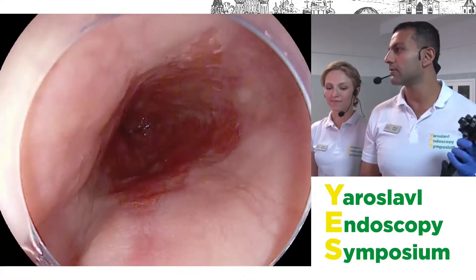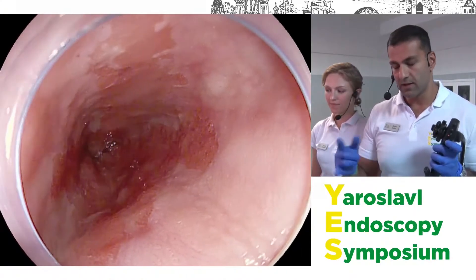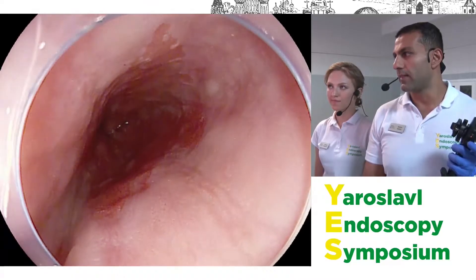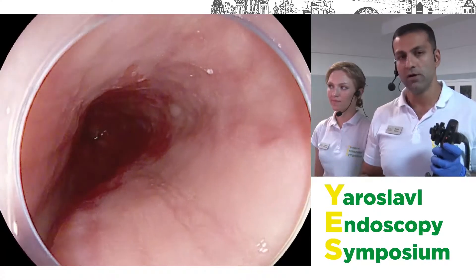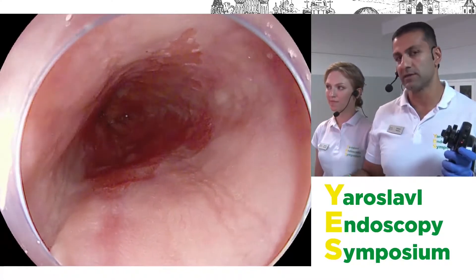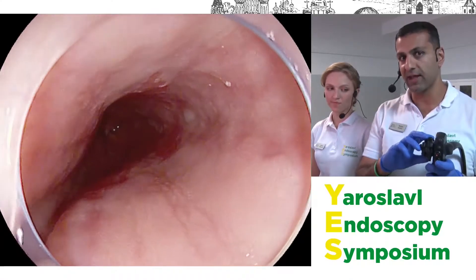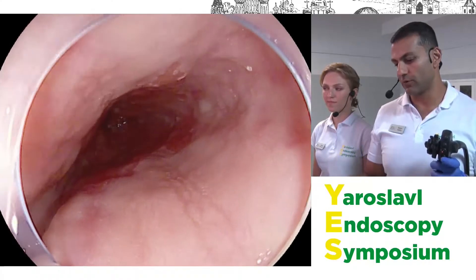For those with experience with Pentax scopes, the benefit of this endoscope and processor is that it combines the best of both worlds. You have the benefit of iScan technology, which is post-processing, but now we also have a filter in the tip of the scope — the optical enhancement — which I will show you later when we're interrogating the Barrett's.